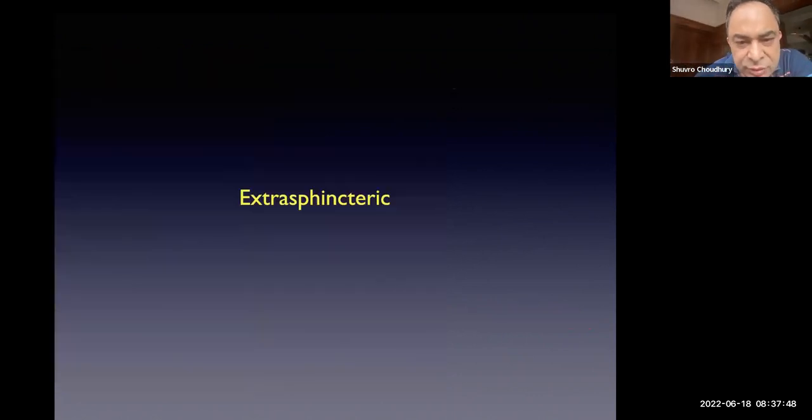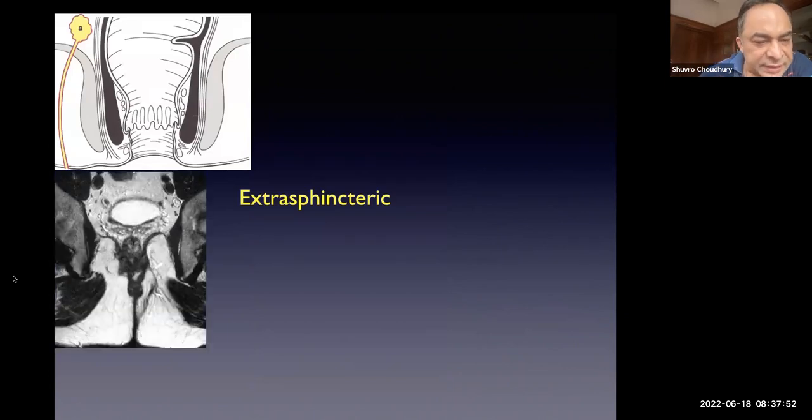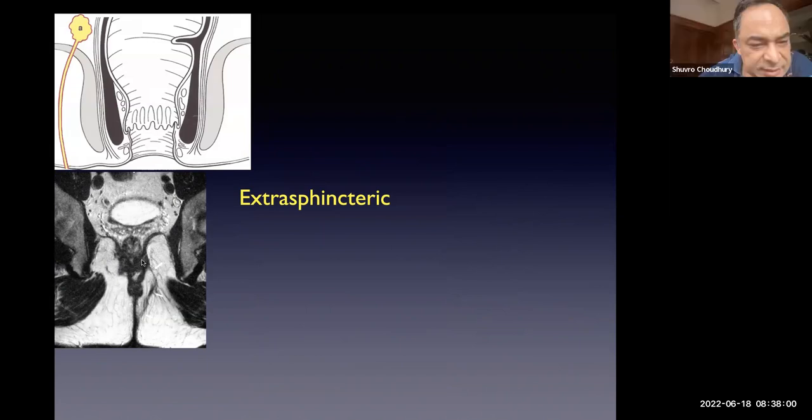So I will try to show you pictures. So, okay, here you can see it very well. This is a T2 weighted image. So this is the levator plate. Yes, okay. So this is a levator plate.